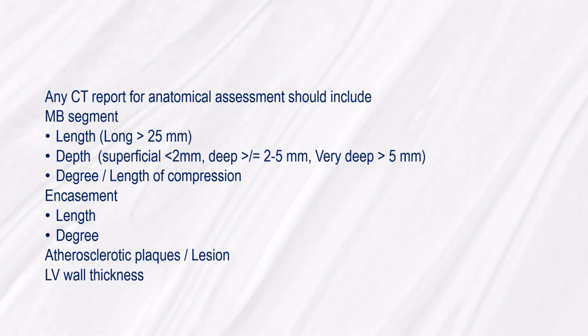Regarding imaging, when any CT report is needed, these questions should be answered: the myocardial bridge segment length and depth, degree and length of compression, encasement length and degree, presence or absence of atherosclerotic plaques and lesions, and left ventricular wall thickness.